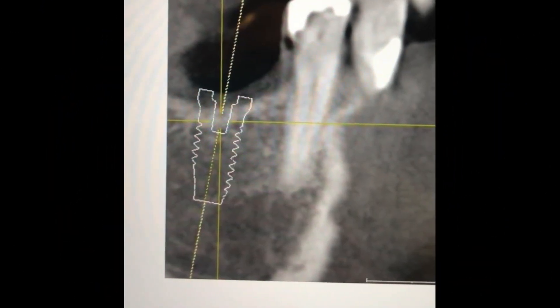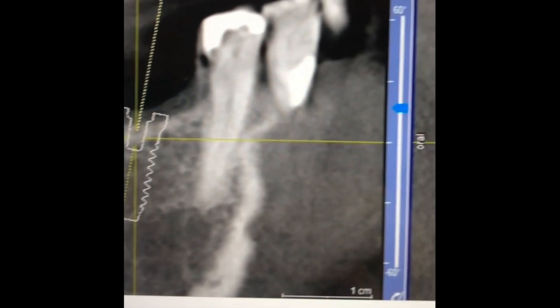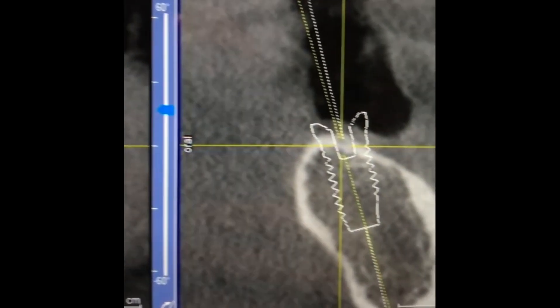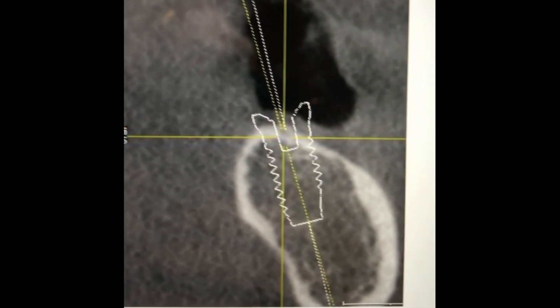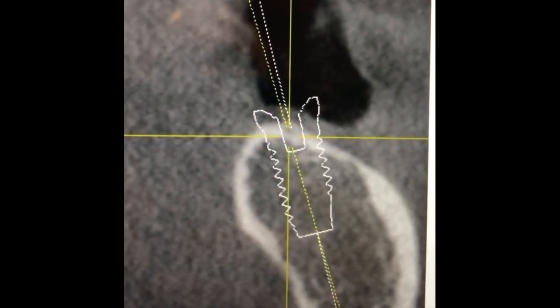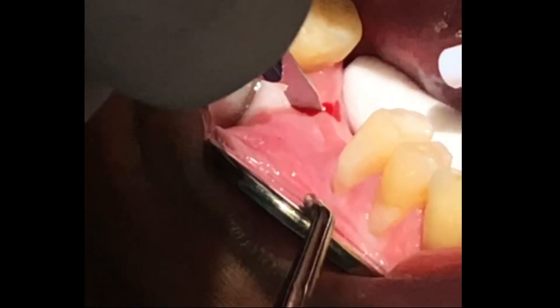Whether one uses fully guided, semi-guided, or no guidance, it is imperative to conduct a CBCT analysis. Once the implant is digitally placed in the appropriate spot, I note landmarks for entry point, angulation, sagittal and frontal dimensions, and finally depth.